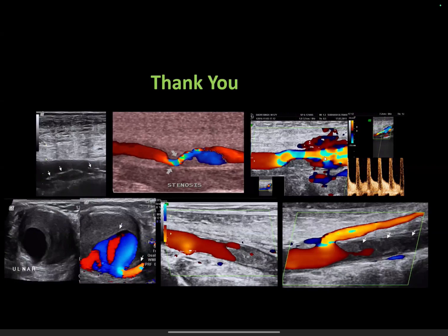If the velocities are high, as we can see here, and the PRF or the velocity range we apply at the time of examination is quite low, then we can see turbulence as well as the mosaic pattern. So first we have to cut the clutter and the aberrant velocities. We improve the PRF so that the intensities are accordingly adjusted and acquired by the color, and then we adjust the color gain if needed to avoid the color bleed. So both are needed to optimize the color image.